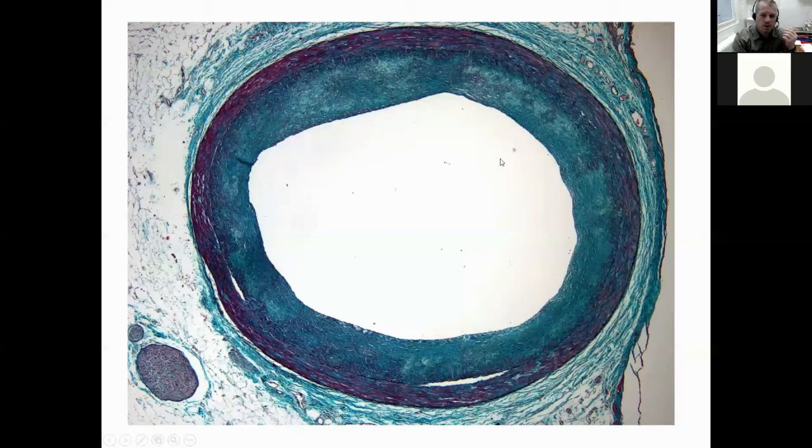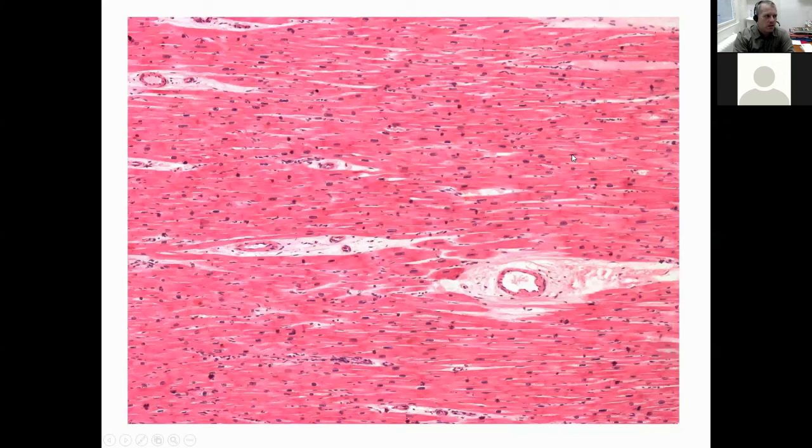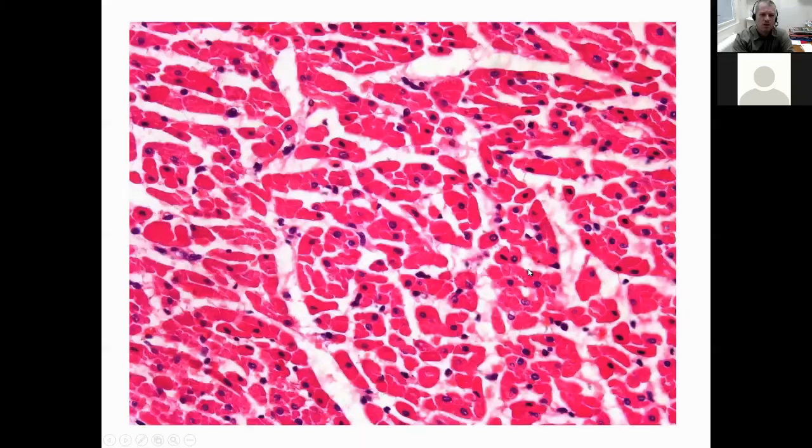And we are already inside the myocardium, you can see the cardiac muscle cells and the blood vessels providing the blood supply to the myocardium. It's a pretty dense vascular network inside, even the small arterioles and capillaries, supplying the metabolic needs of myocardium. These are cardiac myocytes in a cross-section, so you can see the central position of the nuclei here, and the endomysium, the connective tissue here.